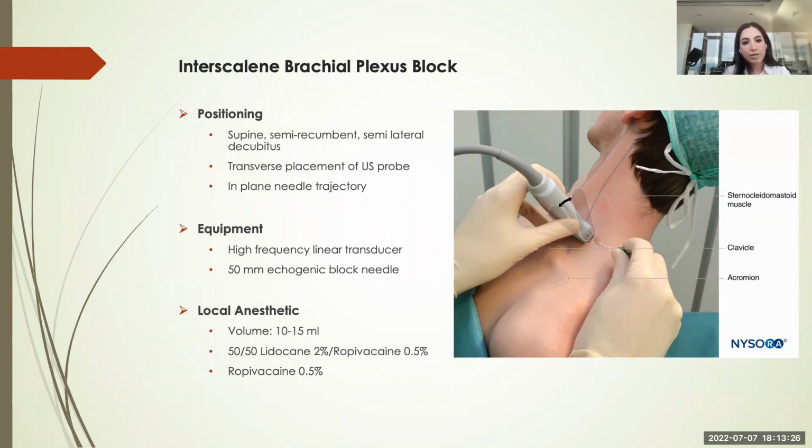Usually we take an in-plane approach from the lateral side of the probe, and so in some cases a semilateral or lateral position may be more ergonomic for the operator, especially when inserting a perineural catheter. It gives your hand a bit more space.